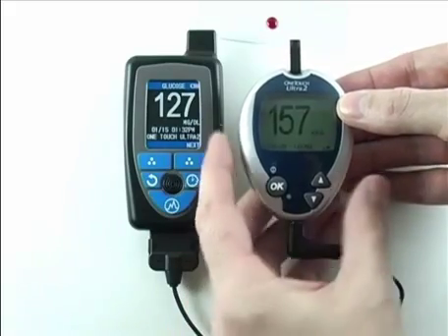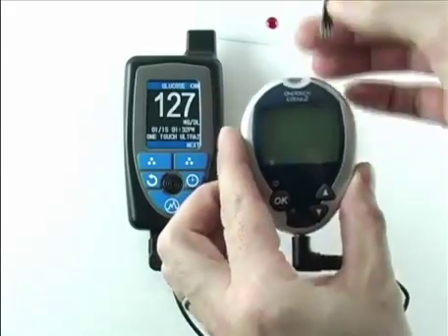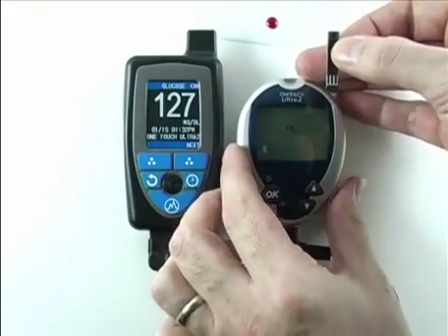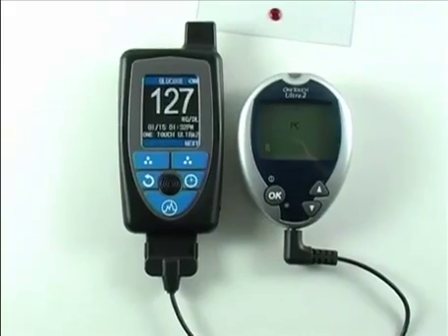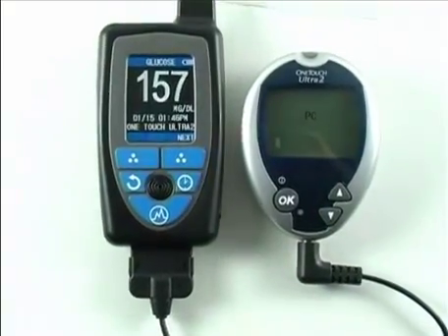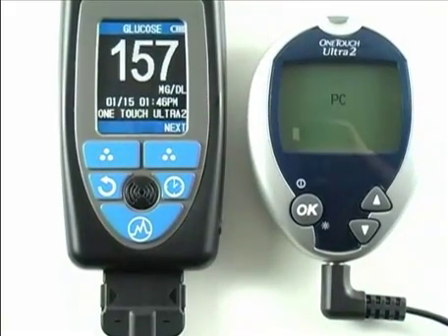When we pull the strip, that initiates the transmission of the reading from the meter to the HealthPal device. When that takes place, you will hear a chiming tone followed by the reading being audibly announced: 'Your blood glucose rate is 157.'